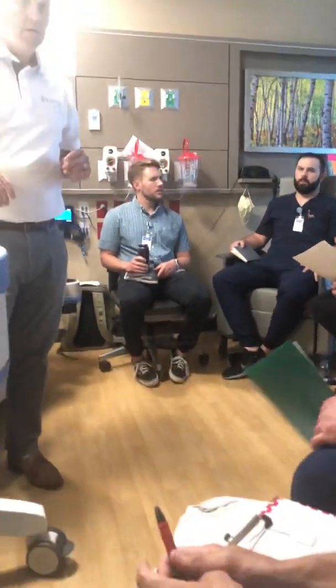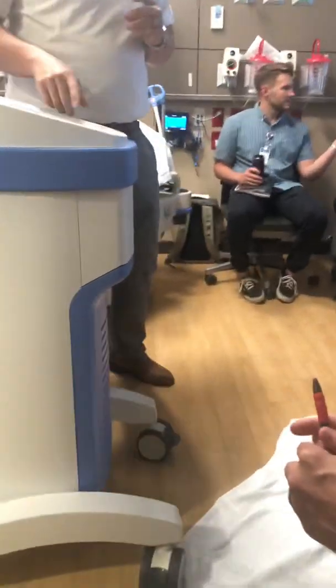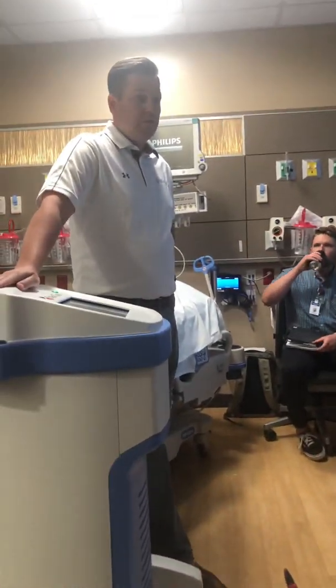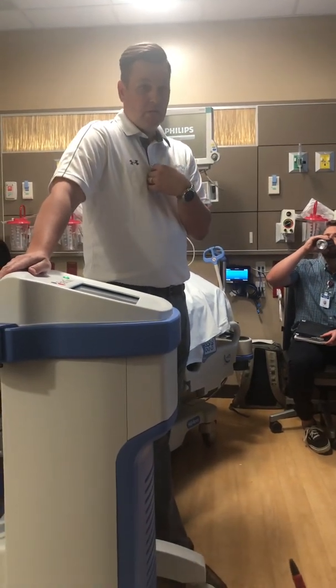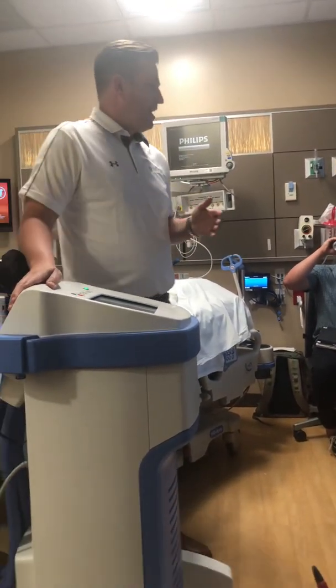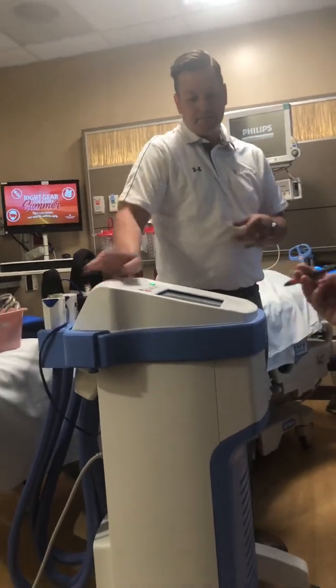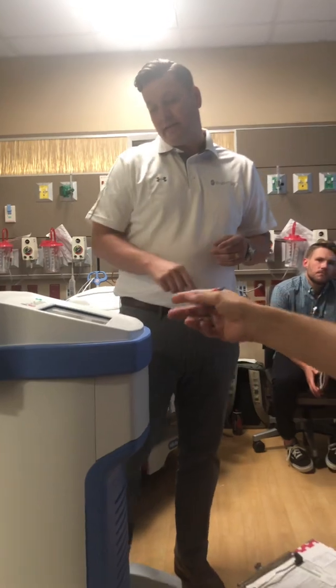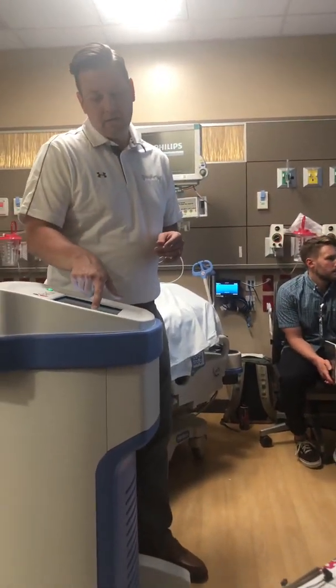So rewarming, we used to rewarm at a quarter degree an hour. Now you're going at 0.1 degree an hour. Is there a reason for that? Who's doing that? That's the new protocol. Oh, that's your protocol. Okay. Slower is always better. I think the default changed to 0.1 degree an hour. It looks like it, yeah. But we used to do a quarter degree an hour. I just wonder if there's a reason for that. Is it saying 0.1 on there?